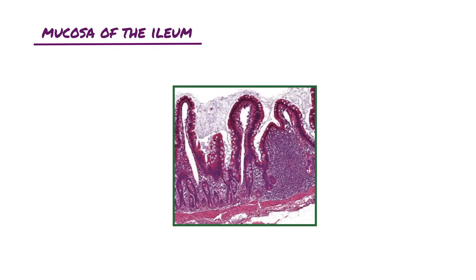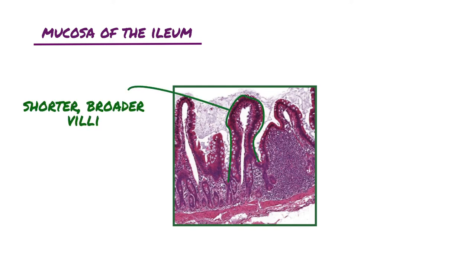Looking at a section taken from the ileum, it has the same characteristics as the duodenum and jejunum. But the mucosa of the ileum can be differentiated by its shorter, broader villi. Additionally, the lamina propria of the ileum houses permanent clusters of lymphoid nodules known as Peyer's patches, which are only seen in the ileum.